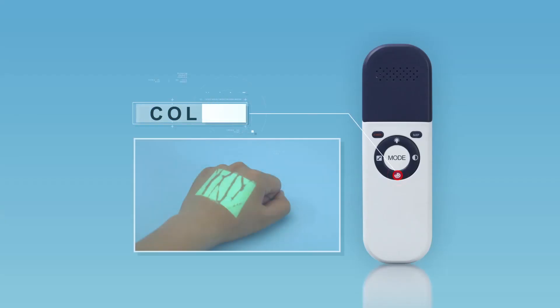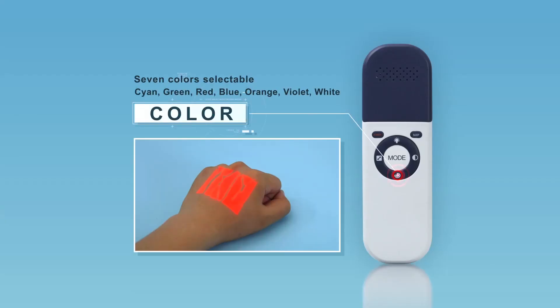Seven colors are available to meet the individual requirements of medical staff and different scenarios. The color can be changed by short pressing the color button.